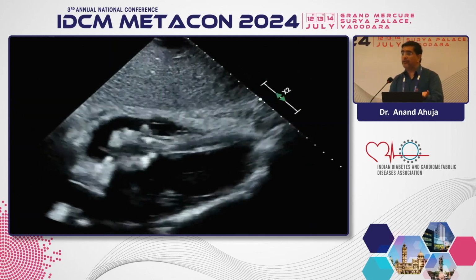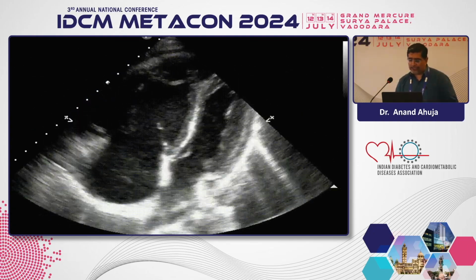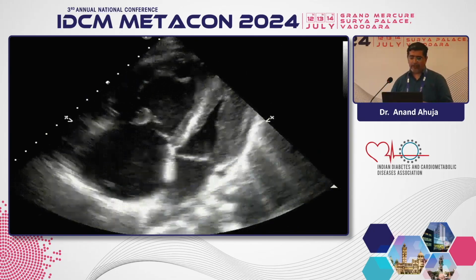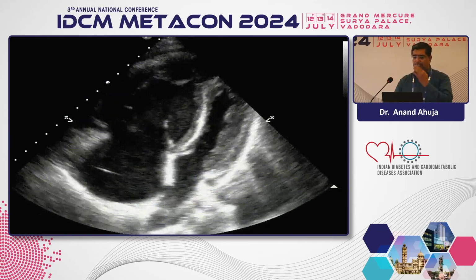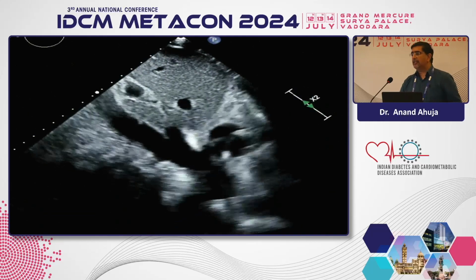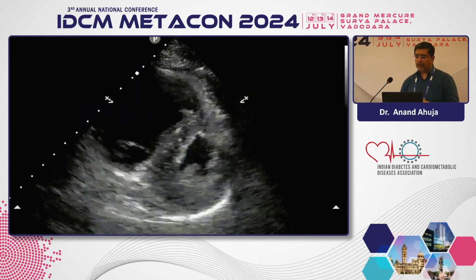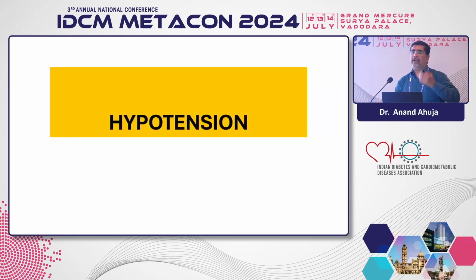Sometimes you might be able to see some thrombus or RA myxoma embolizing. All these things can sometimes be present. So you can see a dilated RA and RV. You can see very clearly that the septum bulges and forms a D shape. The LV becomes underfilled, and sometimes you can see some tumor or a thrombus propping up. You can see the D-shaped ventricle. So these are the classical clinical presentations, and even for pulmonary embolism, bedside echocardiography is very, very essential.